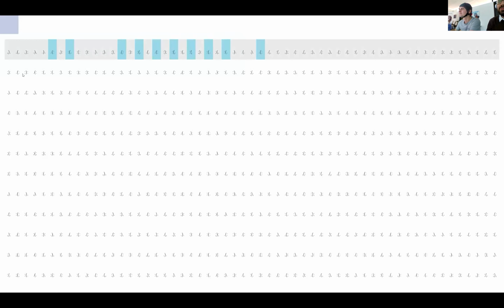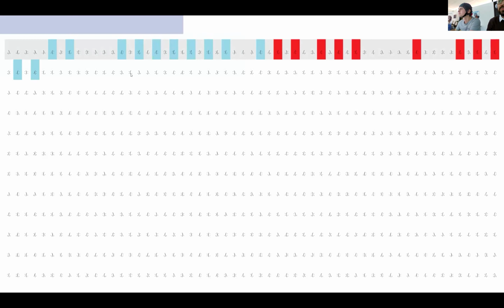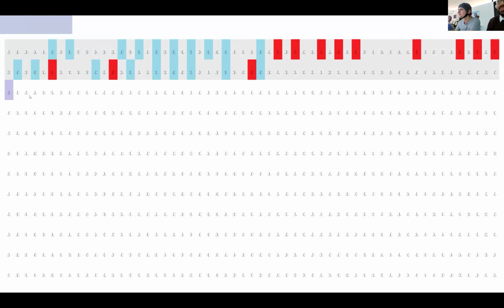As I'm talking, I'm putting extra pressure, which is not part of the paradigm. So he was unable to finish the first row. Let's see how he performs in the second row. I was a bit mean and decreased the normal speed for the sake of the presentation and to increase how nervous they get when they're trying to find all the three dots.